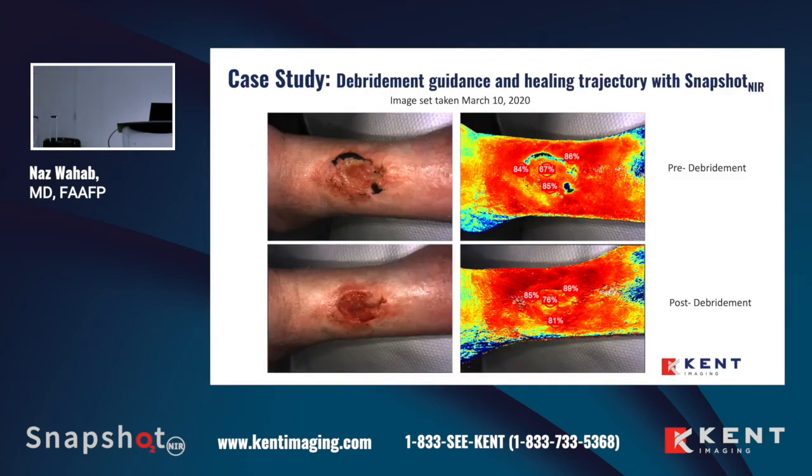This is another one you can see, and what I want to show you is that the numbers are very important as well. Sometimes you may not realize that the numbers don't need to be a significant improvement, but an improvement. With this technology, it's a comparison over time. Yes, you can get a snapshot, and an idea and an average at one time, but really where the magic happens is when you're taking serial images over time. Serial images from your interventions, whether topical or surgical, it doesn't matter, but over time.